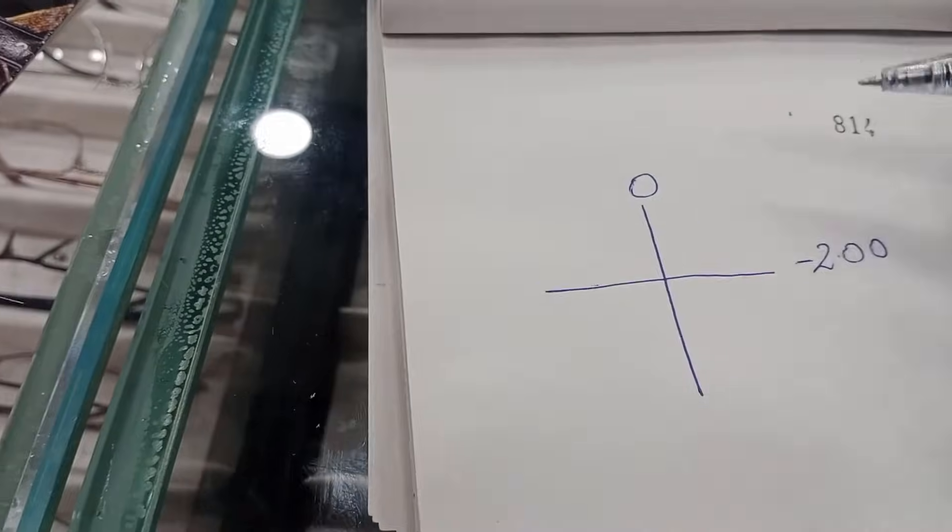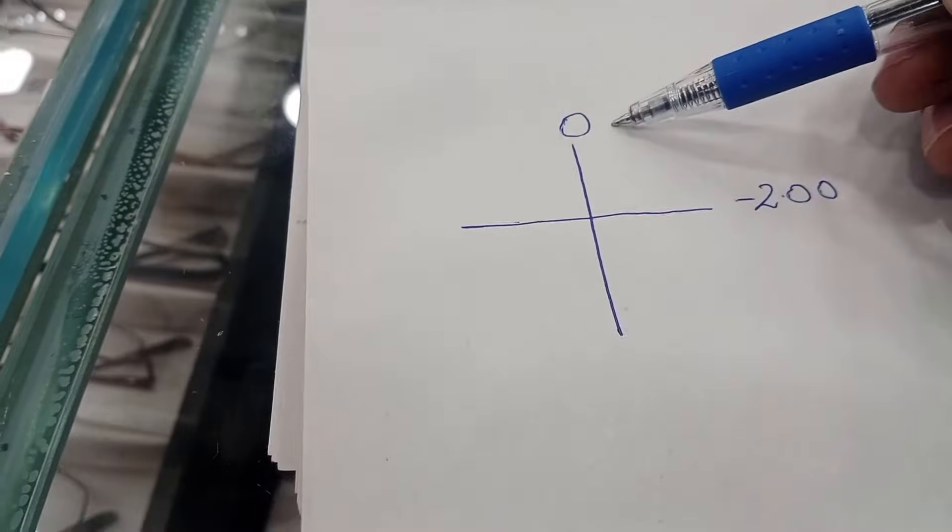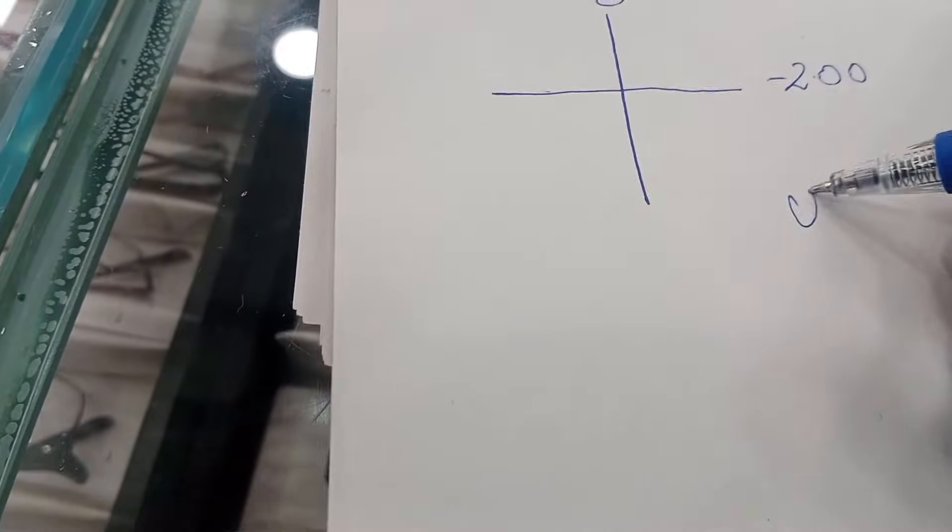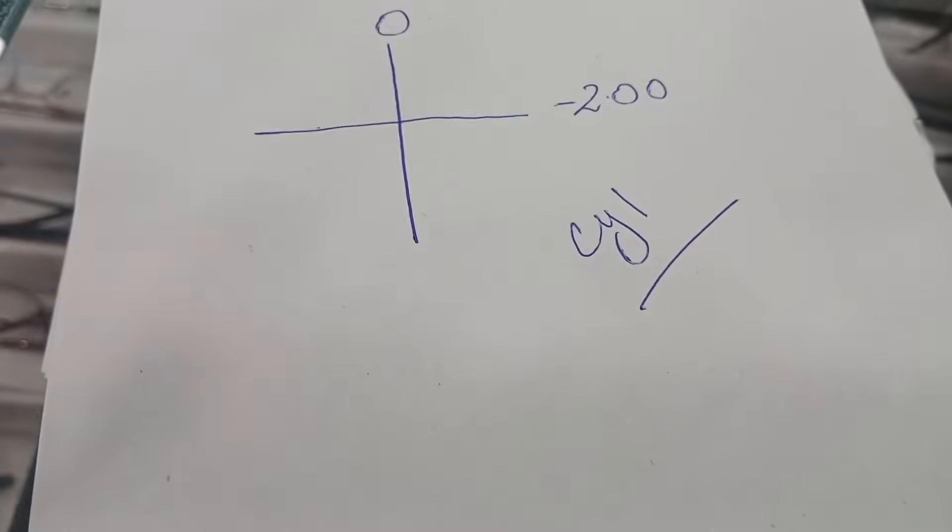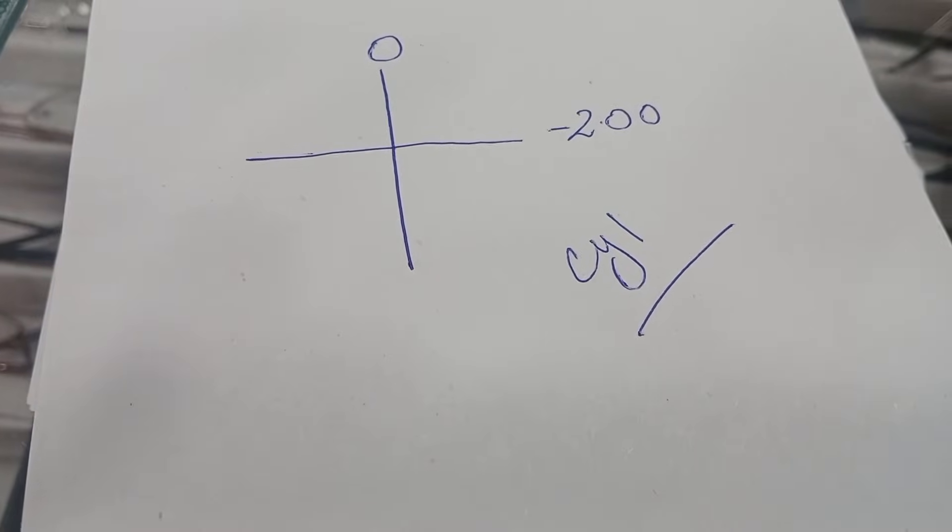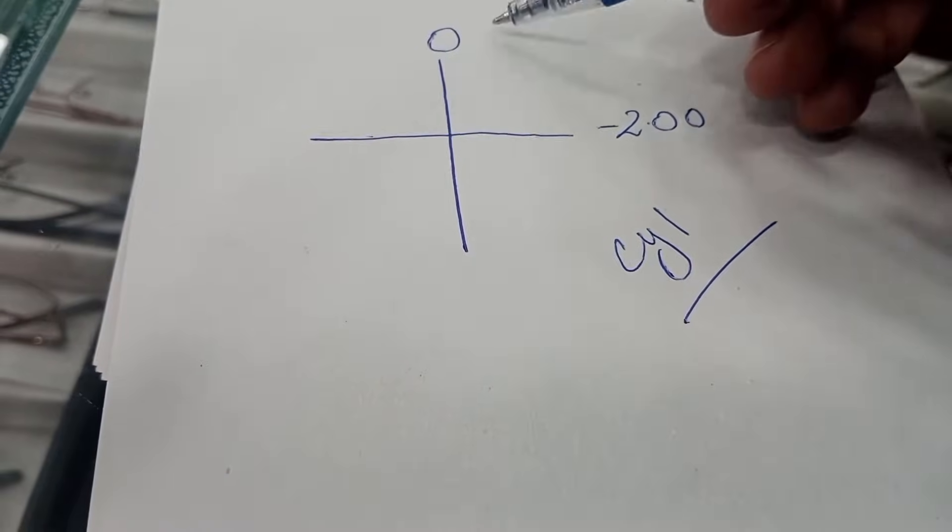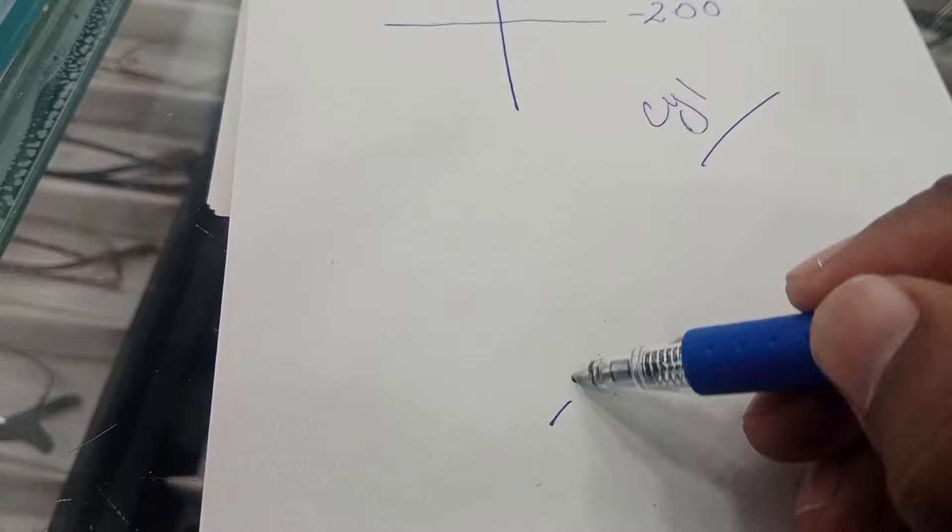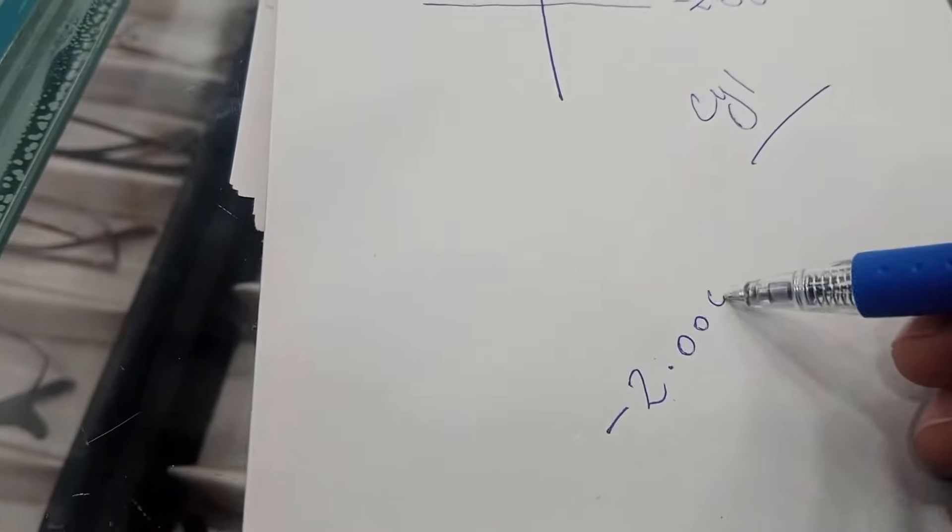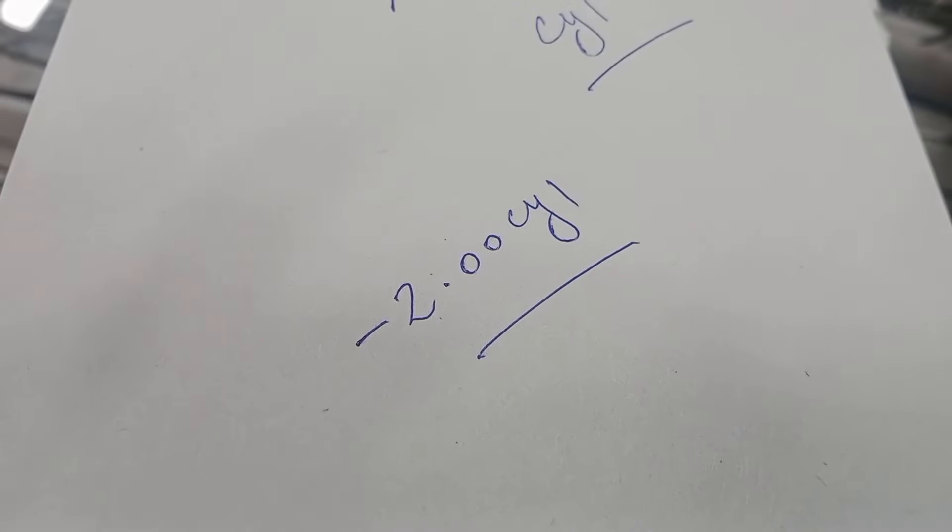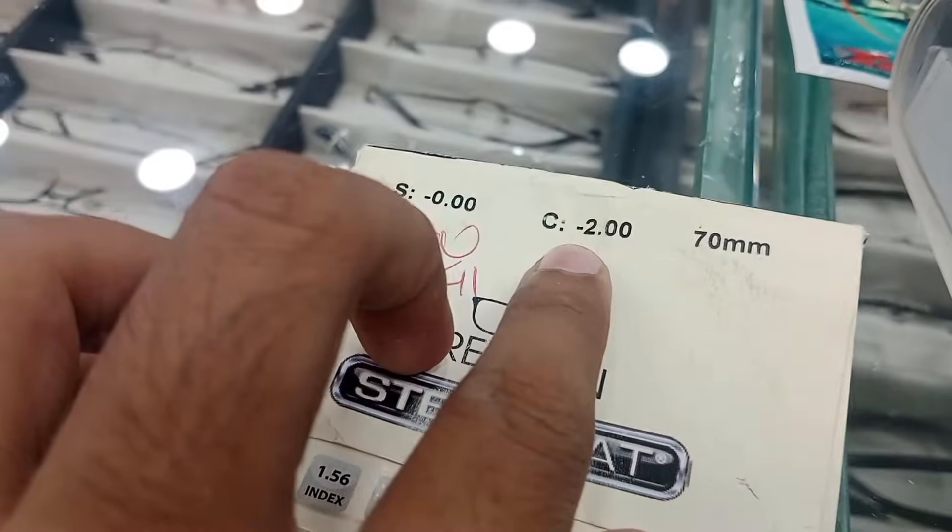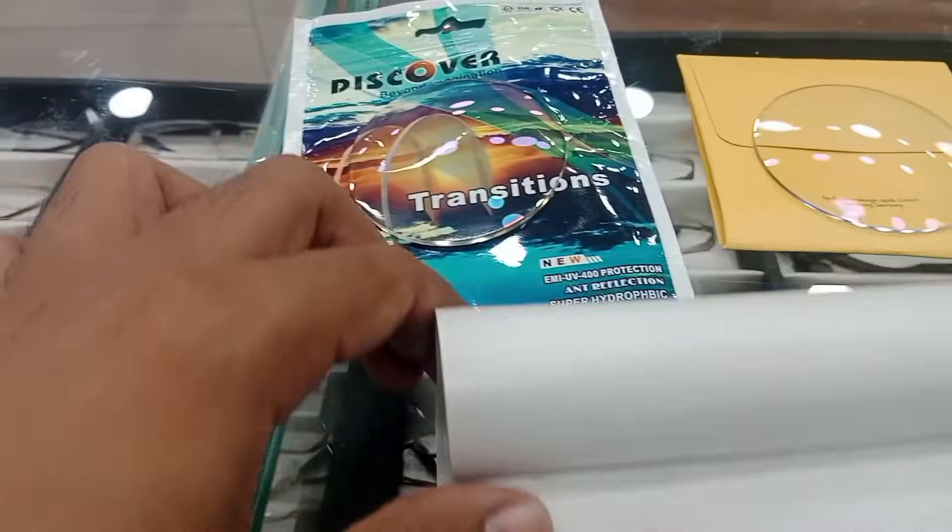So if we move from zero to minus 2, it will be a cylinder, right? So it's zero. We are moving from zero to minus 2. So the sign will be minus and the power will be cylinder. So yes, we have confirmed we have minus cylinder.